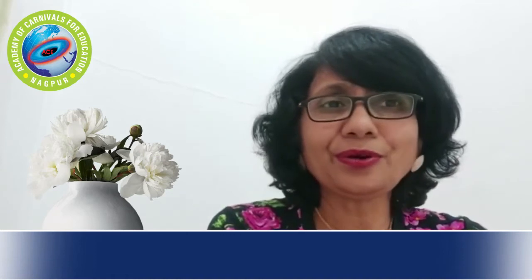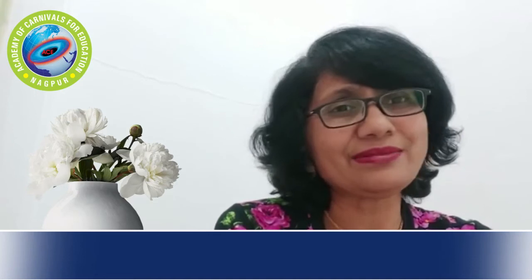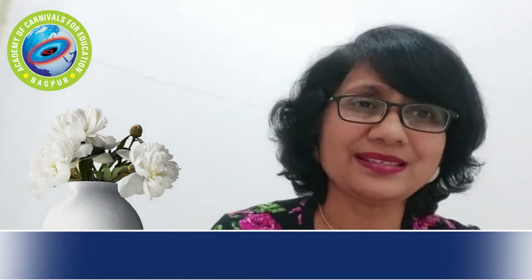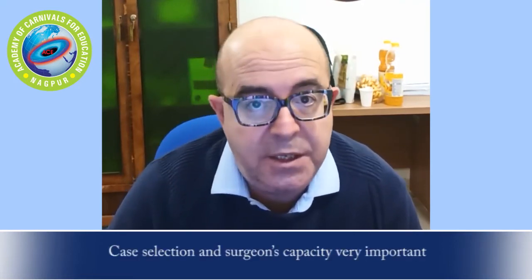Complications during an operative procedure are very traumatic for the doctor as well as the patients. So, how to minimize these complications? How to avoid or minimize complications? The first rule of surgery is primum non nocere, as the Latins say. First of all, never dare with fibroids that you are unable to remove safely.